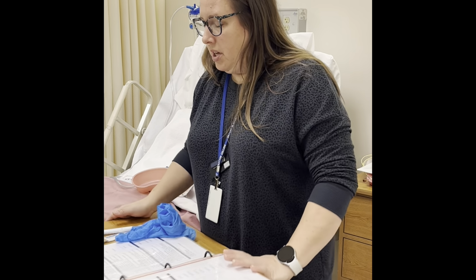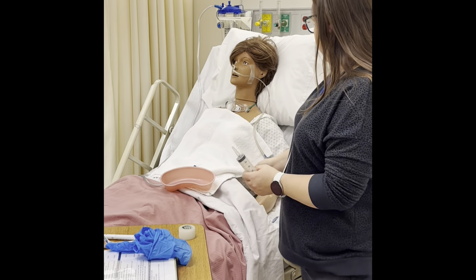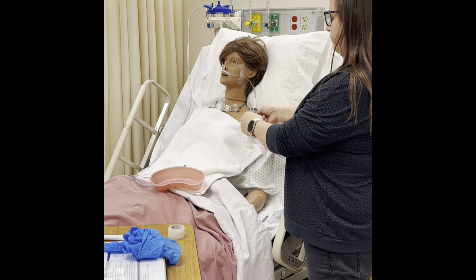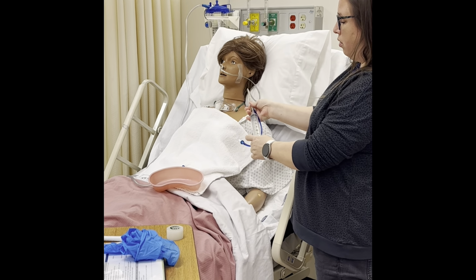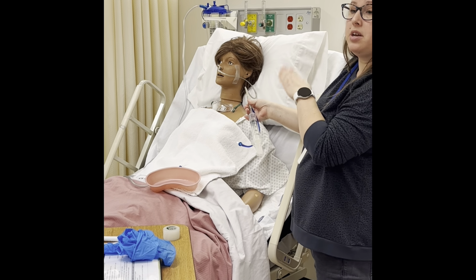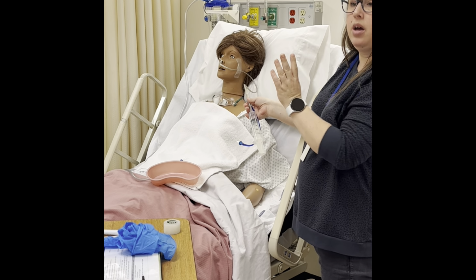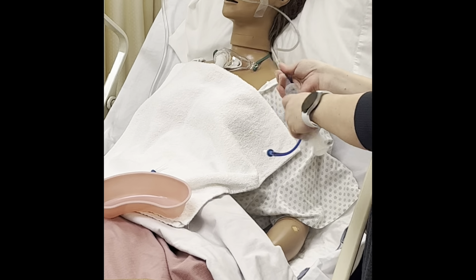So now we're going to take our 60 cc syringe, this large one, and we're going to put it on the end of this tube, on the clear side, and we are going to pull back 10 to 20 cc's of gastric contents. This is how we're making sure that the tube is inside the stomach. We used to x-ray, we used to put air in and listen with the stethoscope. We don't do that anymore.